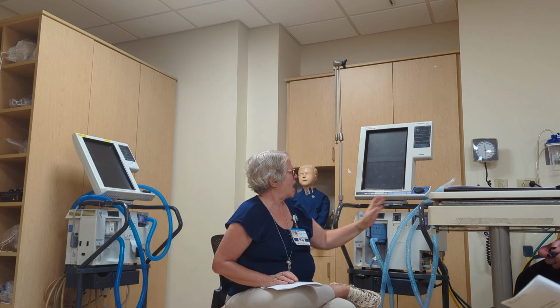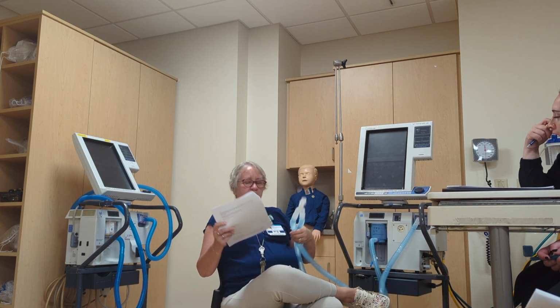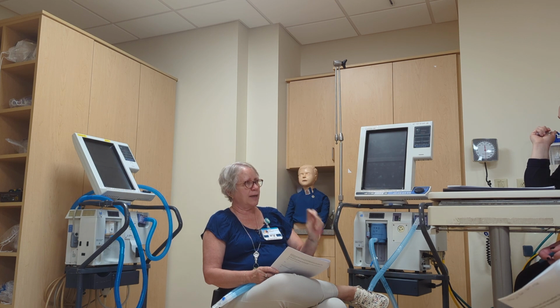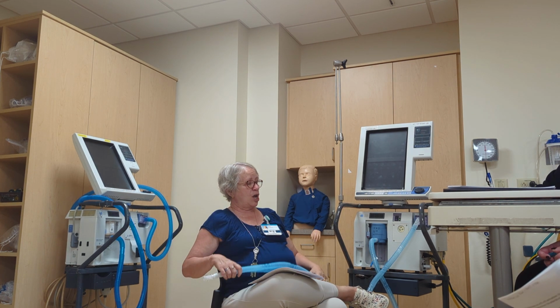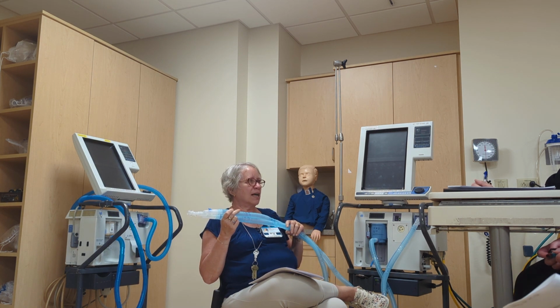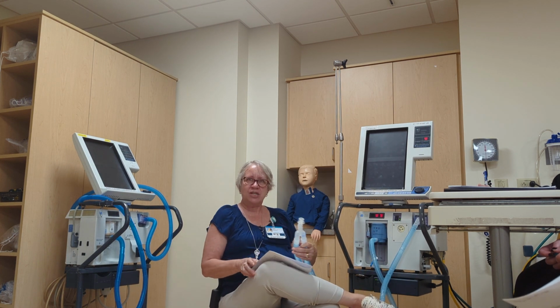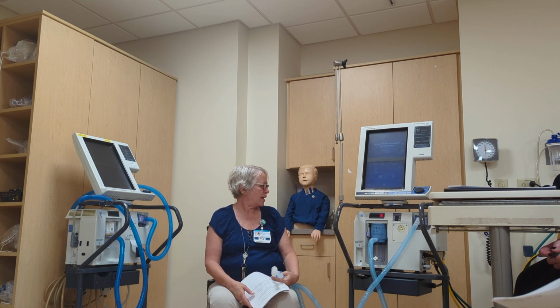Okay, so that is step 1. And that number is our compliance number. That's our tubing compliance number. Step 2: I know that's how stretchy or stiff my tubing is. That's what that is telling us. Next, I'm going to go put this on my patient on their regular settings.